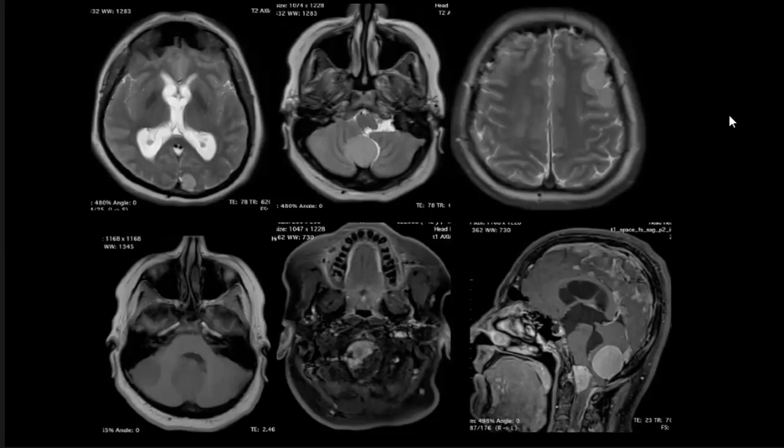Okay, so you said that there are more than one lesions, right? Yes, madam. Is this one lesion or multiple lesions? Multiple lesions. Okay, so one in midline in the region of cerebellum. Yes. Are these intra-axial or extra-axial? Madam, the one at the level of foramen magnum seems to be an extra-axial lesion. There are two lesions in the region of foramen magnum, one anterior and one posterior. Both of them are extra-axial.